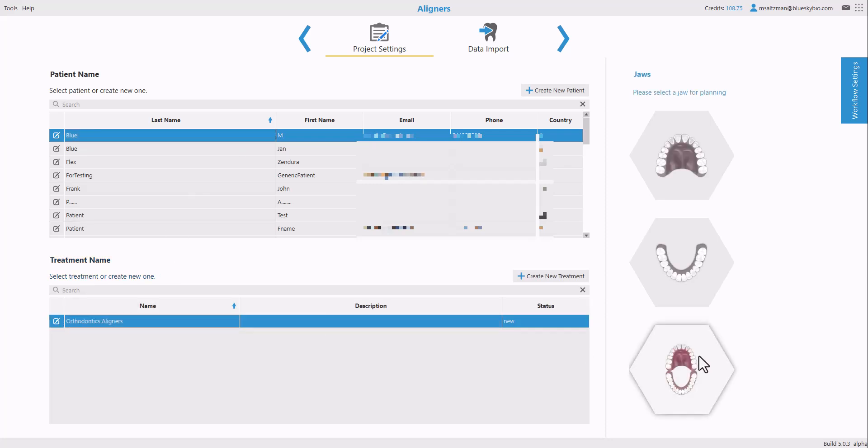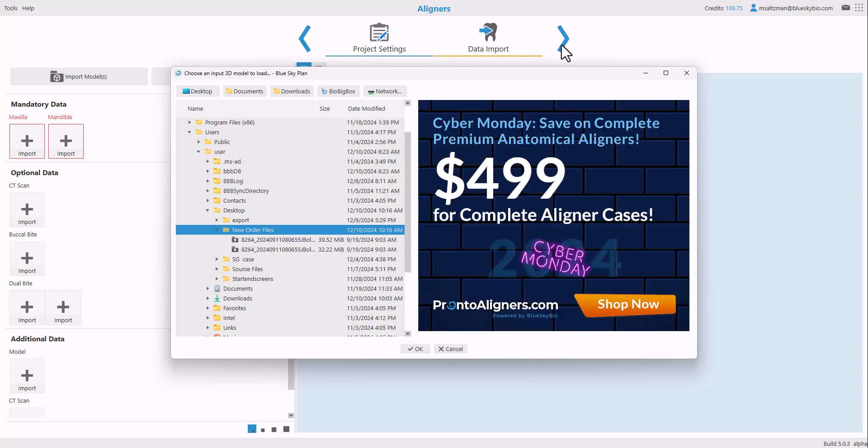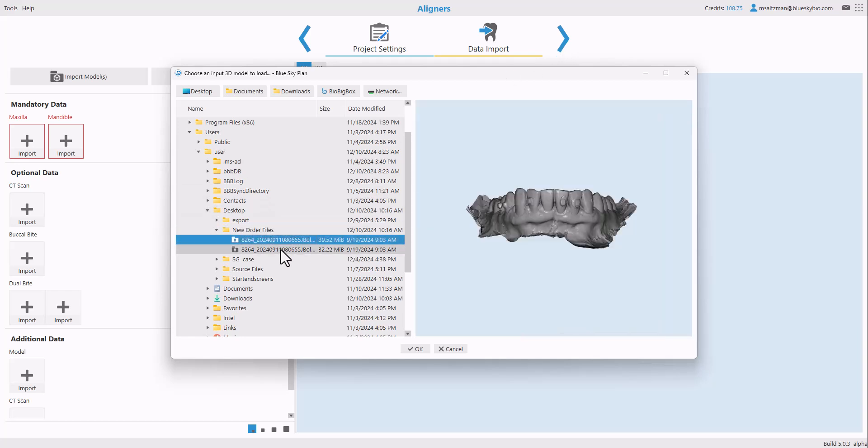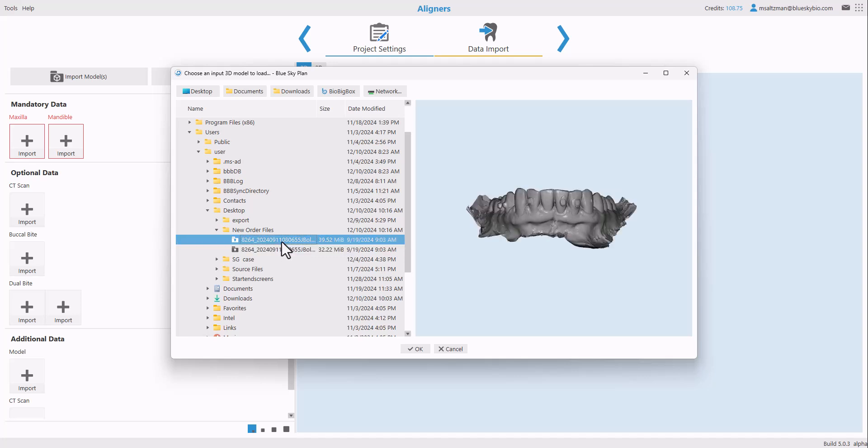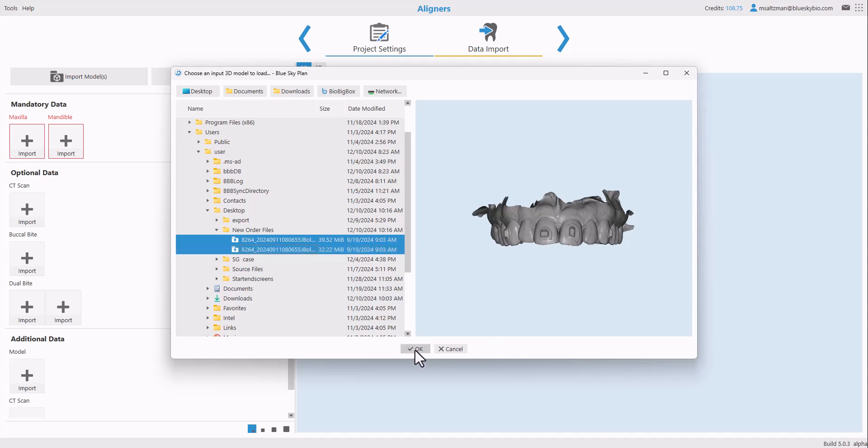We're going to select both jaws and click the Next button. We are now going to select the new files for the new intraoral scan or model scan that was taken. Left-click the first file, hold down the Shift key, and left-click again to multi-select multiple files. Once the relevant files are selected, go ahead and click on OK.